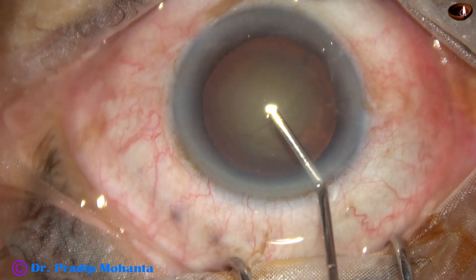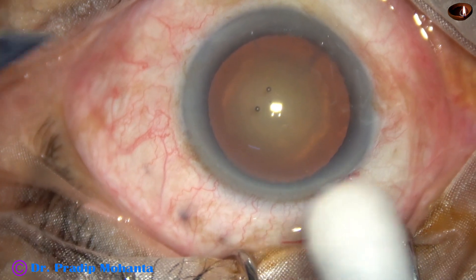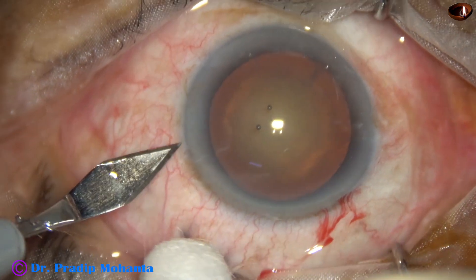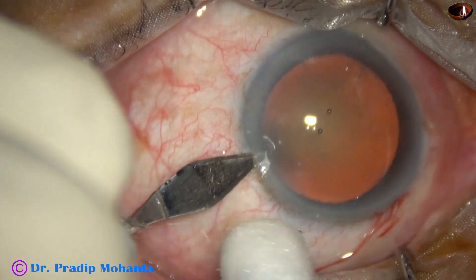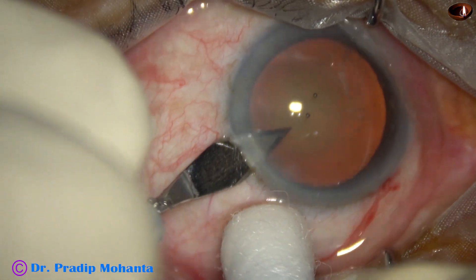The main incision has been made on the posterior aspect of the limbus. The anterior chamber is filled up with 2% hydroxypropyl methyl cellulose. The side port is made about 3 o'clock hours away from the main incision.